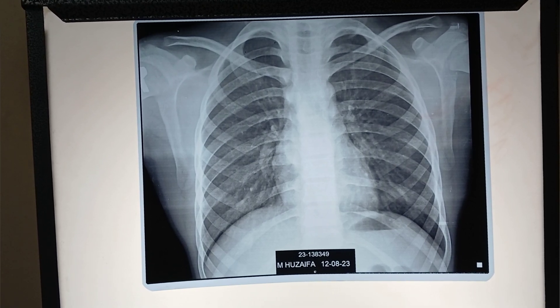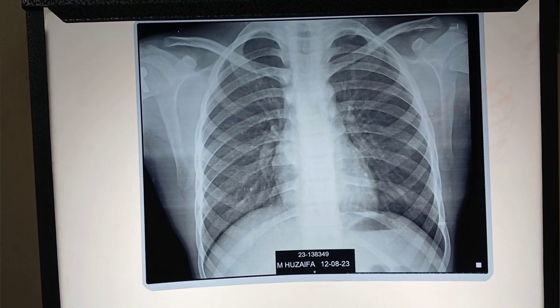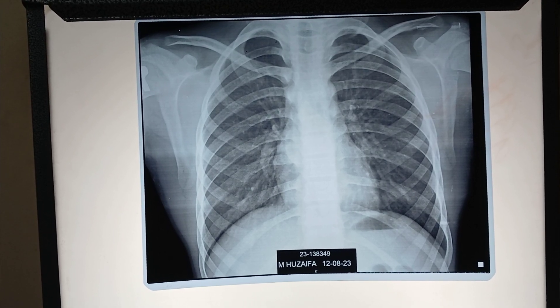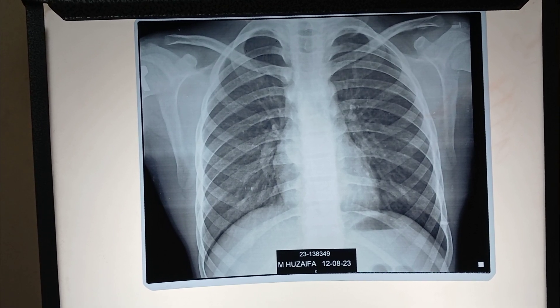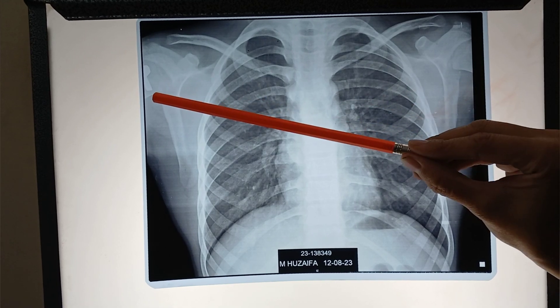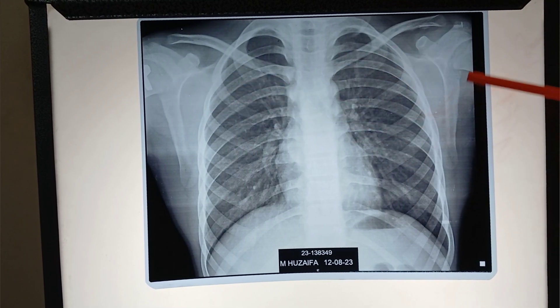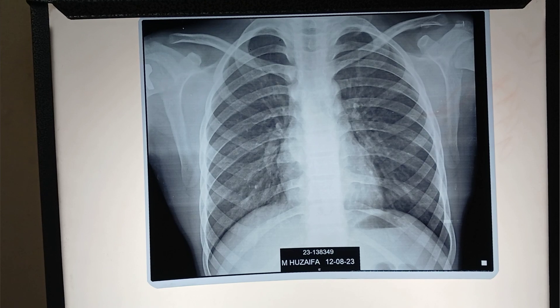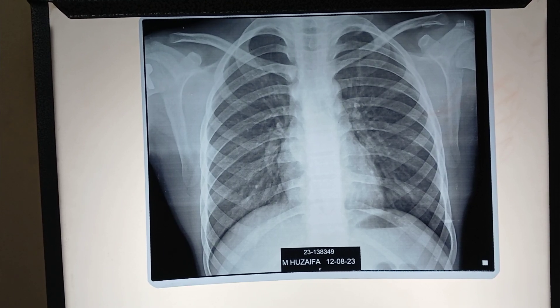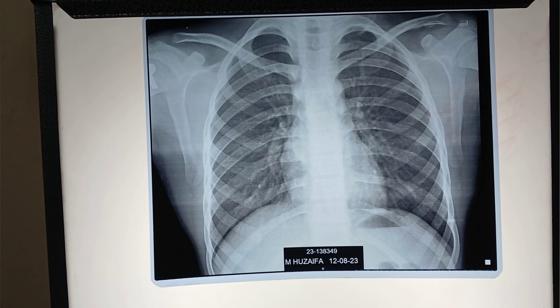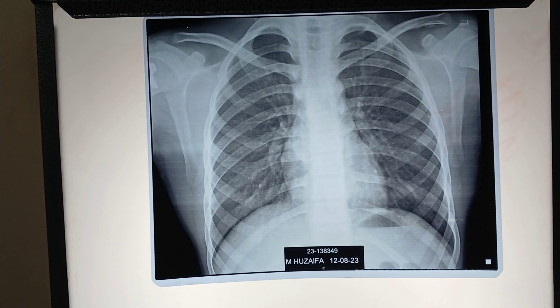Starting from the basic, when you start reading the X-ray, you need to know which is the right and left side. It is marked on the X-ray in the form of a marker. As you see here, 'right' is written. So this is the right side and this is the left side. Always imagine the patient to whom the X-ray belongs is facing you. The right side of the chest X-ray is your left side and the left side of the chest X-ray is your right side.